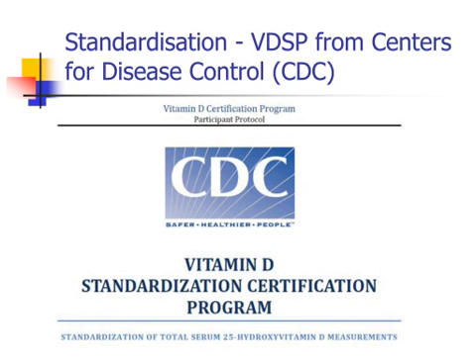And to get around that, CDC have released this standardization program where you get sent out a number of samples that you measure with your method of analysis, and so long as you get results that are within about 5% of what the higher order reference methods get, then you're awarded with a certificate from the CDC to say that you can measure vitamin D properly. This is something that we would do if we started a large research study, but it is something we're quite keen to get involved with.